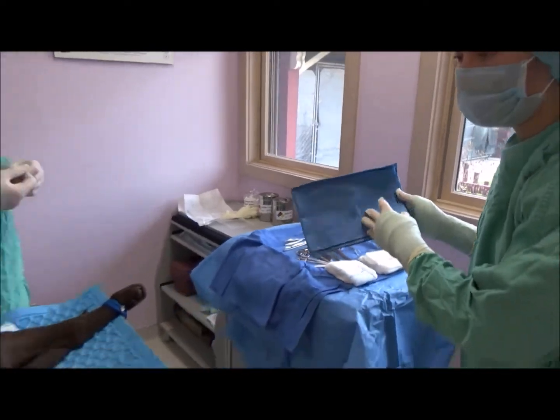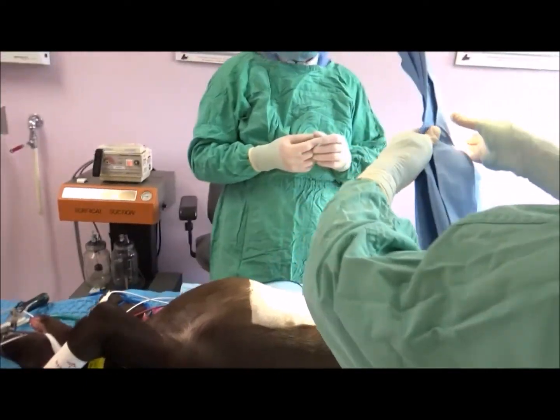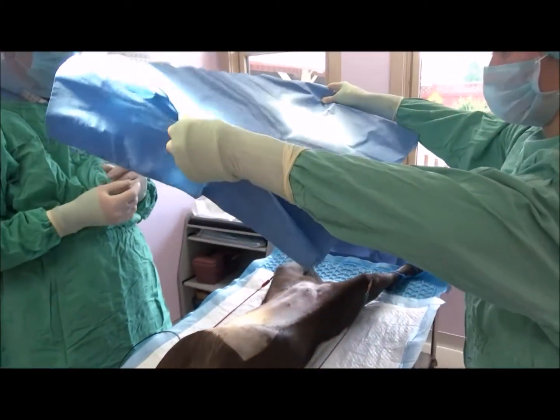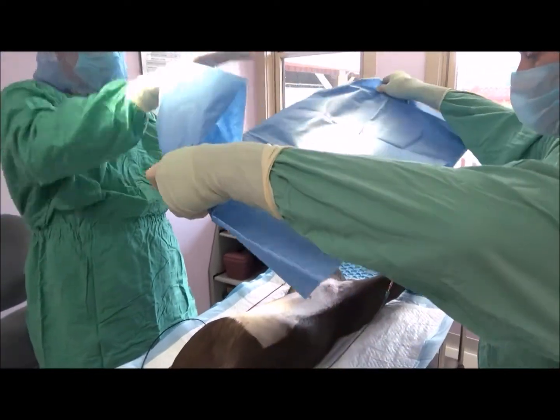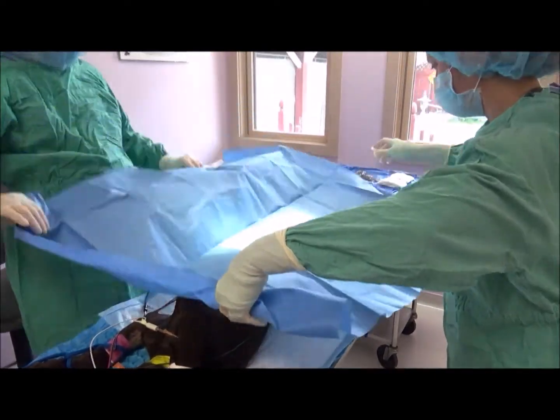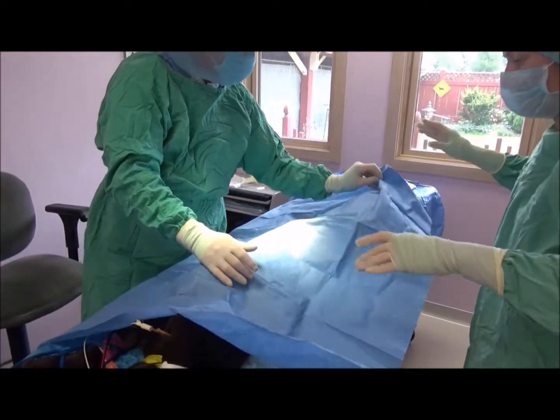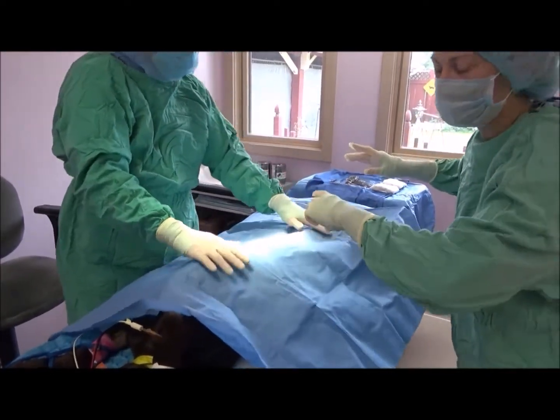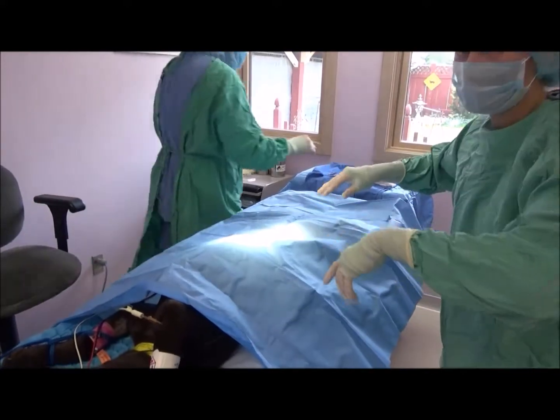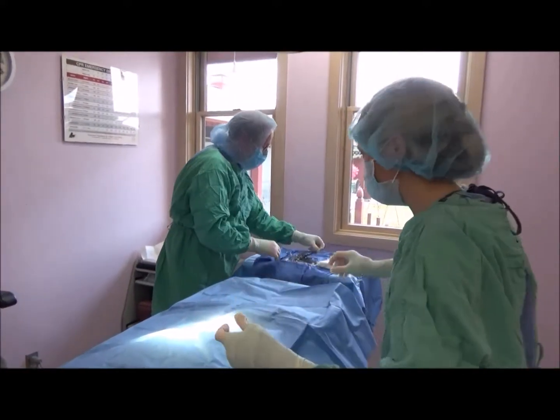So now we're going to drape the patient here. And we use a paper drape. So the doctor will make the fenestration in this drape, and then after he's made that fenestration, then I'll go ahead and I'll place the towel clamps.